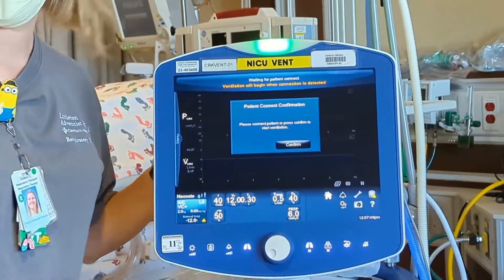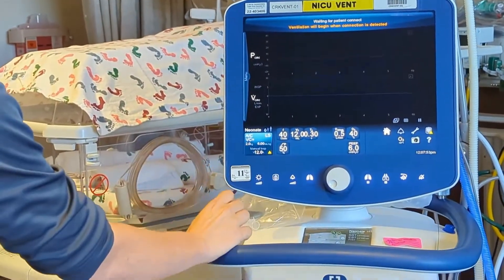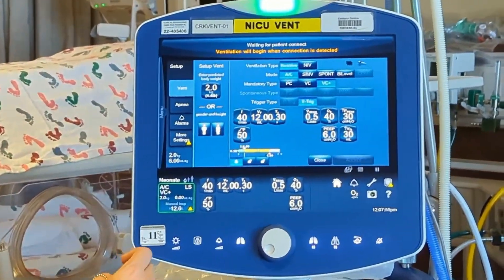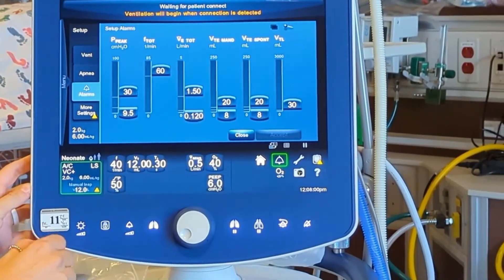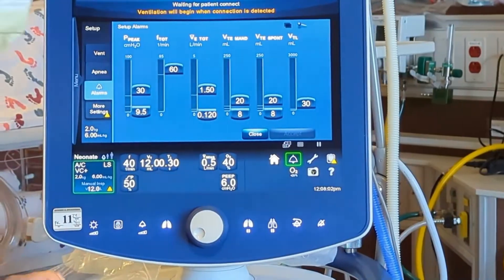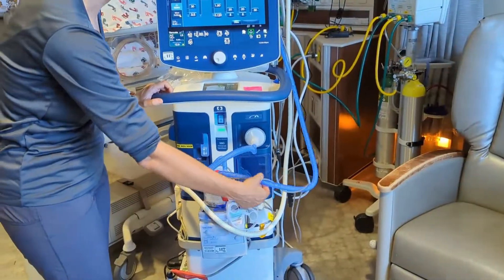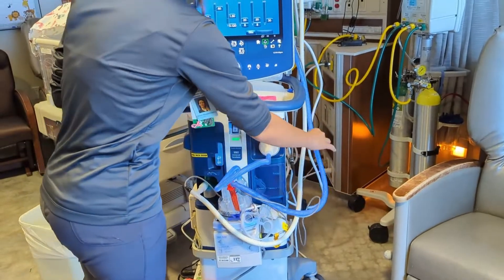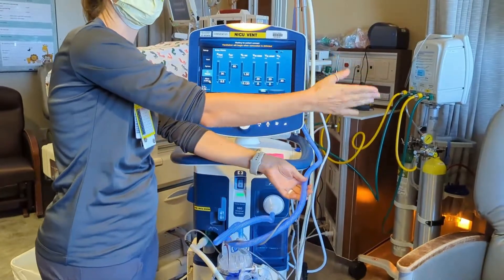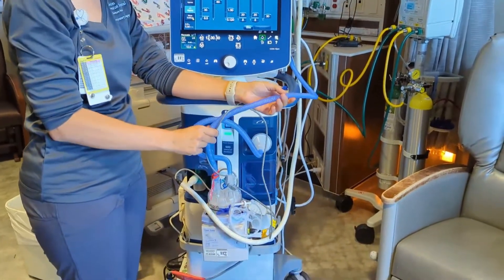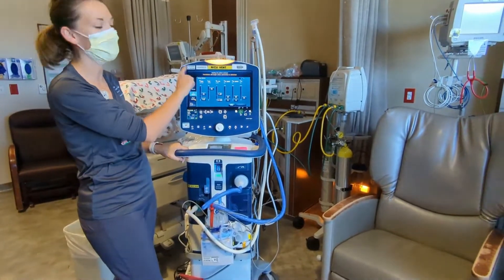Most often on this ventilator, your peak pressure alarm is going to go off — maybe your baby's coughing or crying. Additionally, if we have a lot of condensation in the circuit, it can cause a peak pressure alarm as well. We're going to drain this down away from the baby — we don't want it going down the ET tube. We want to flush away from the baby. Once it's drained, if that was the cause, you'll see that alarm go away.